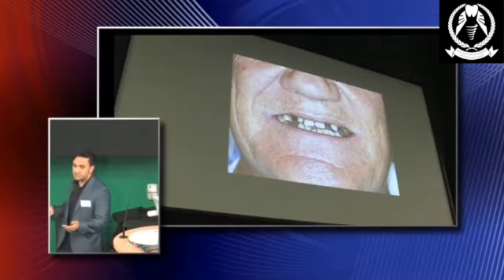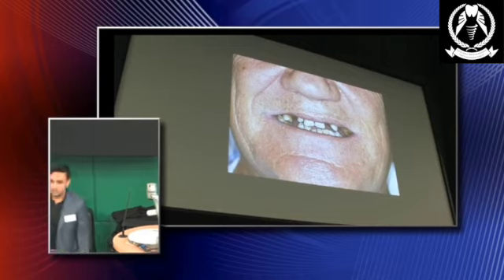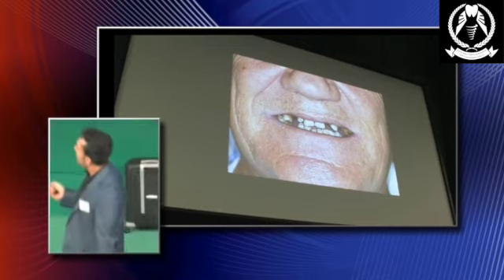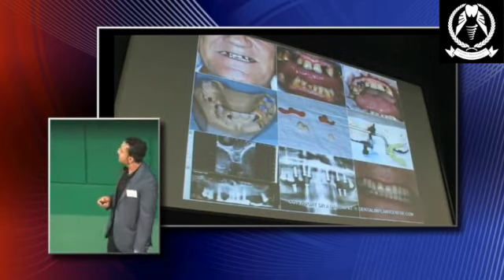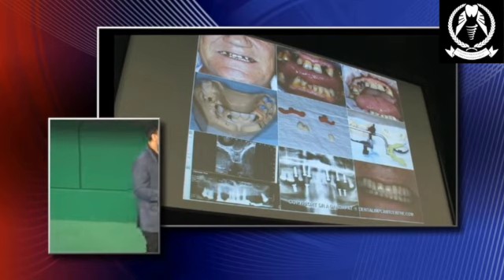And there's a lot of spaces, the gums are stable, but these teeth are rock solid. The last thing I wanted to do with these teeth is actually take them out and give everything based on implants. They're rock solid. So we worked around the options here. And this is kind of a summary of what we did.